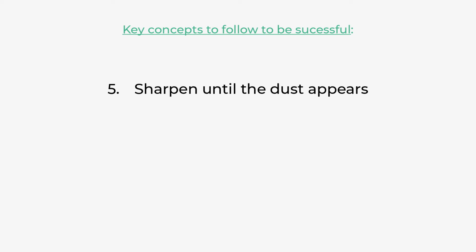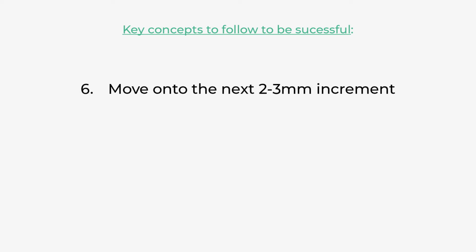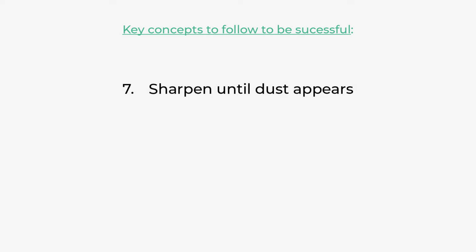5. Sharpen until the dust appears. 6. Move on to the next 2 to 3 millimeter increment. 7. Sharpen until dust appears in this section. 8. Continue this process until complete.